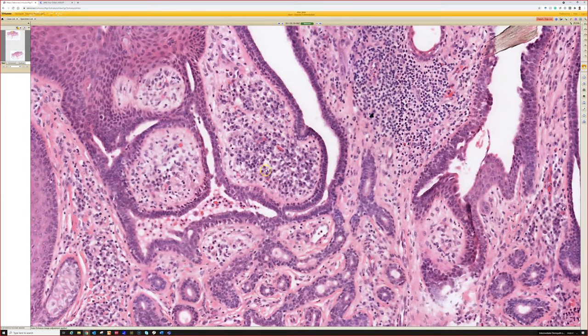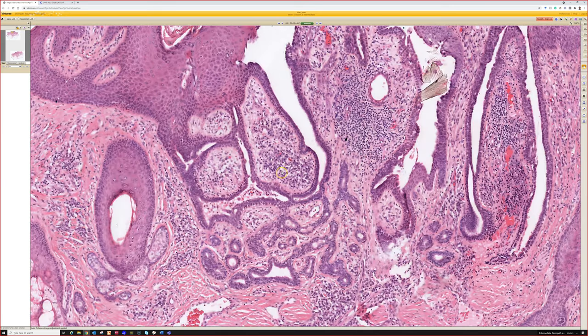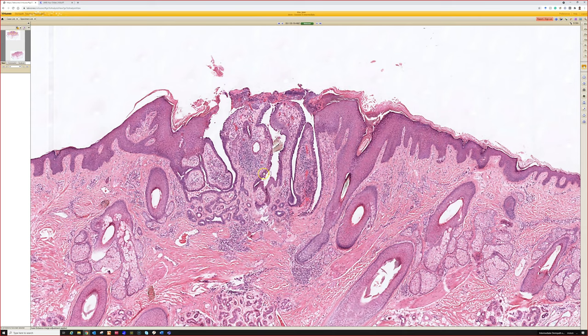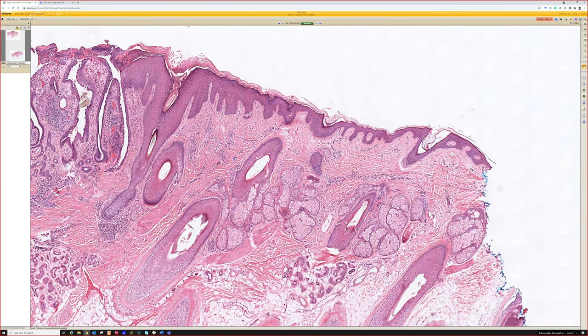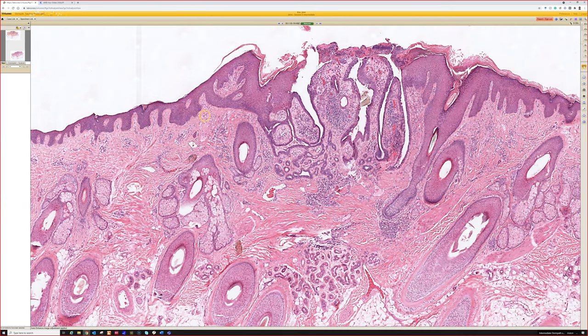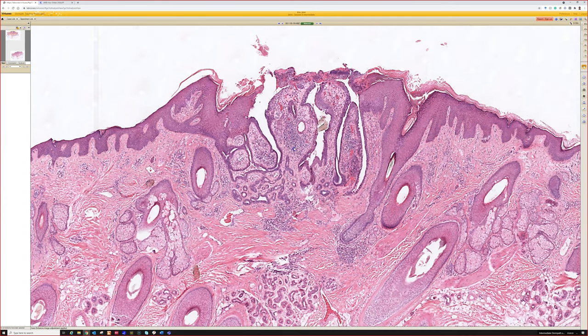This one doesn't have that many. There's some right there, but it's still not a ton. But usually a lot of plasma cells around this for some reason. And most commonly these occur on the scalp in the setting of nevus sebaceous. And even though we don't see great features here, per the study set guide, this is actually arising in a nevus sebaceous.